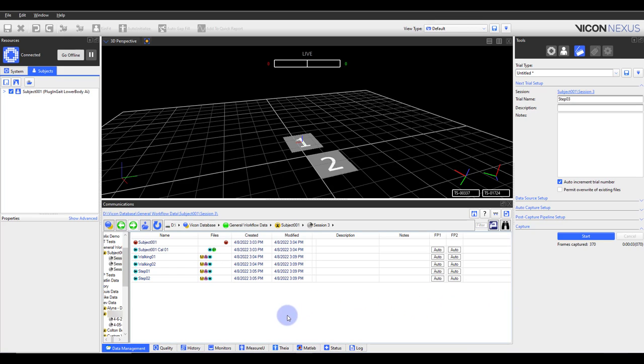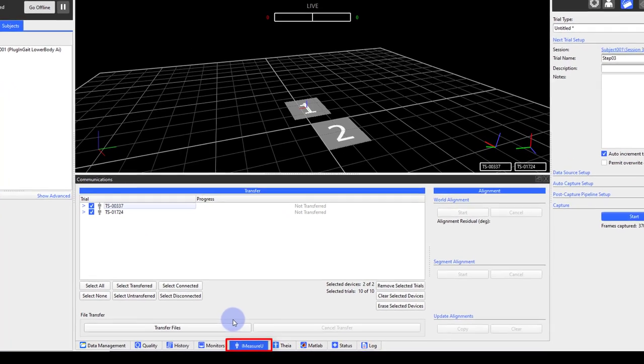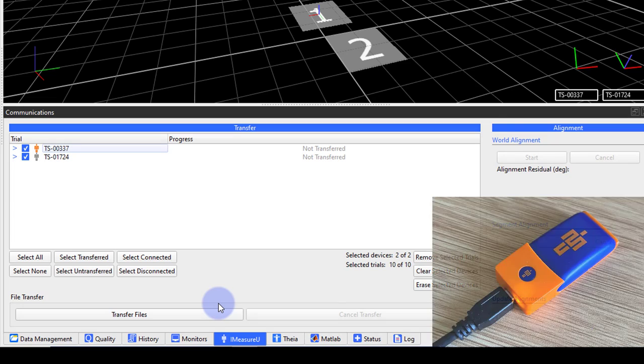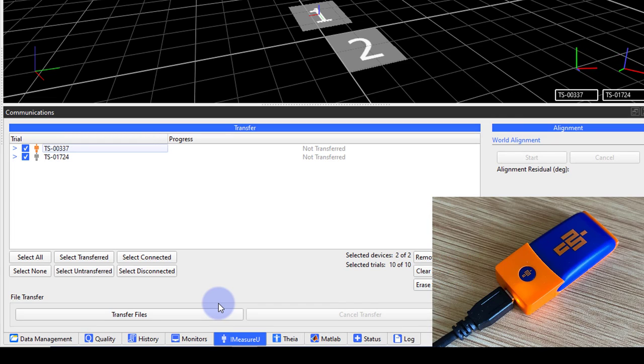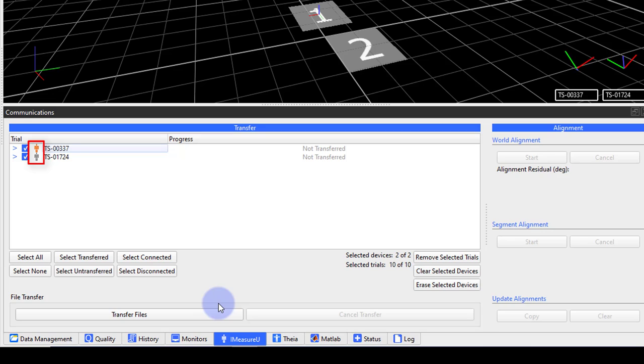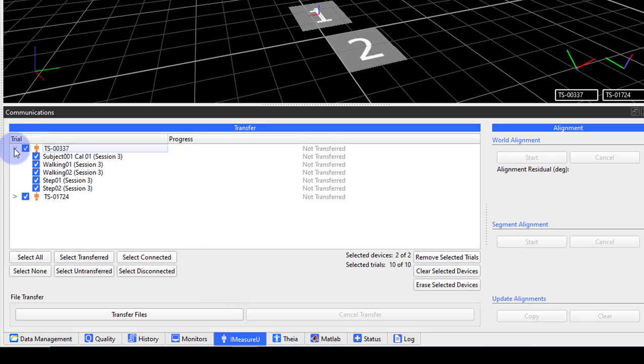To transfer data from your IMU sensors, navigate to the IMU tab in the communications window. Next, cradle the sensors and connect them to the PC. You will see the IMU logo turn orange for all the sensors connected. You can also expand the sensor to see all the trials saved on the sensor and their transfer status.